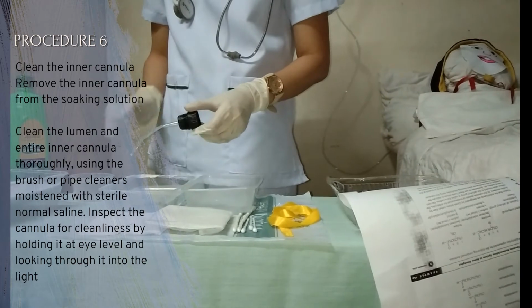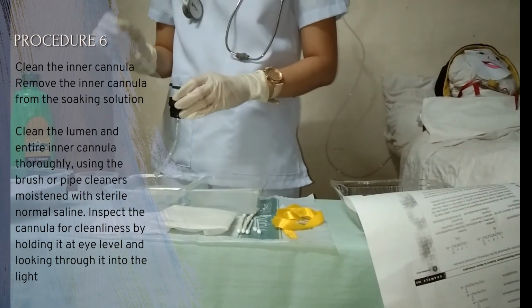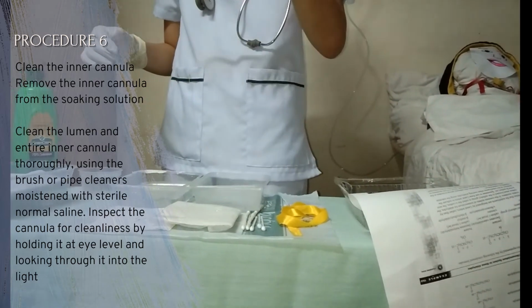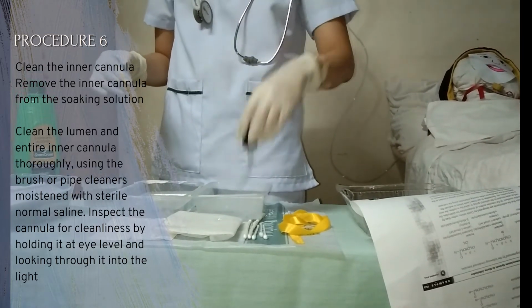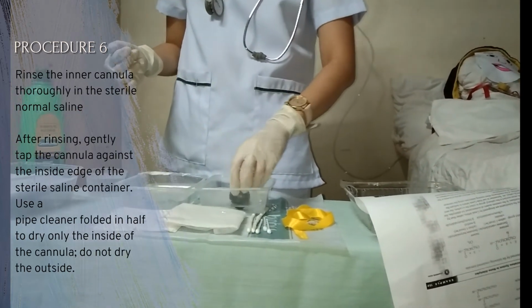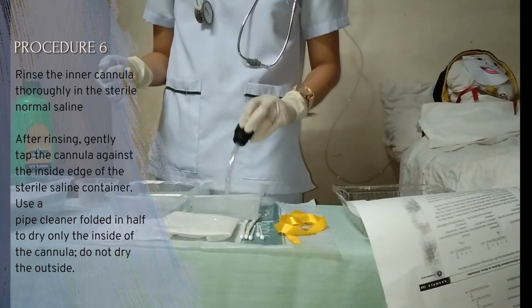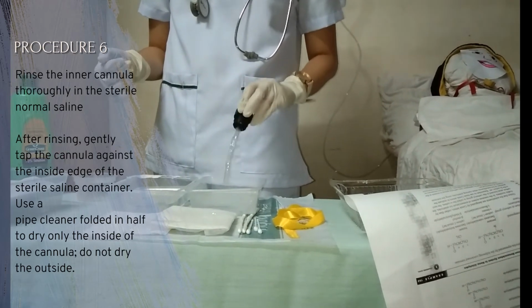Clean the lumen and entire inner cannula thoroughly using the brush or pipe cleaners, moistened with sterile normal saline. Inspect the cannula for cleanliness by holding it at eye level and looking through it into the light. Mechanical force and friction are needed to remove thick or dried secretions. Rinse the inner cannula thoroughly in the sterile normal saline. Rinsing and agitation removes secretions and water from the cannula. It also provides lubrication for easy reinsertion.